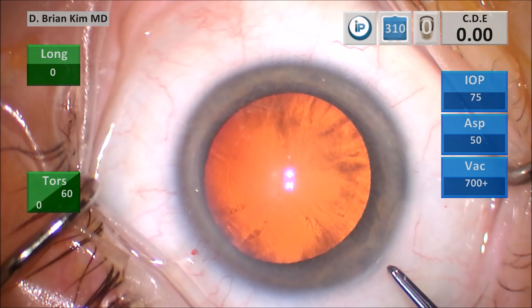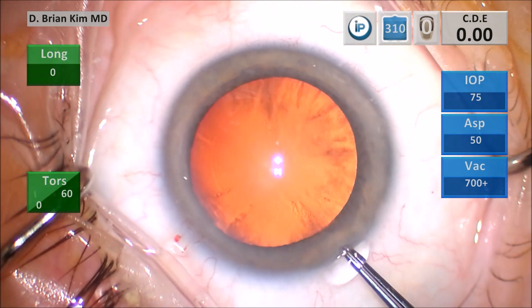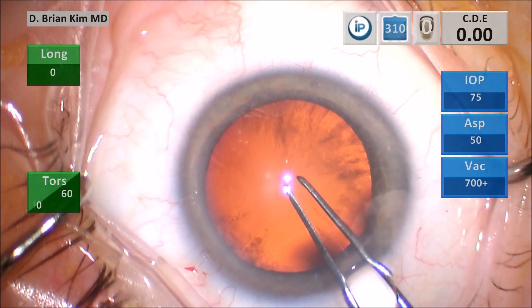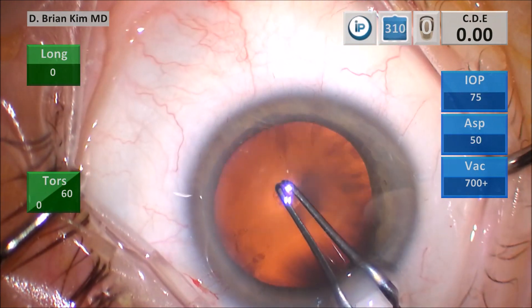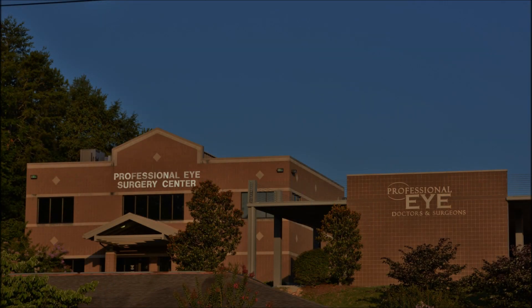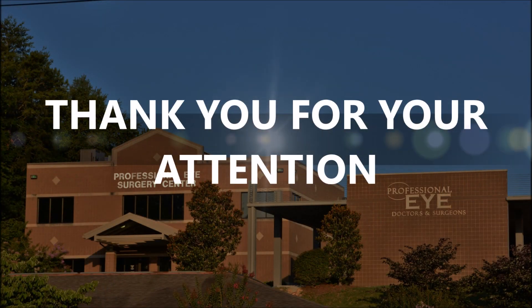I hope you see the value of creating a triplanar corneal incision. I believe it provides more stability, and using the cannula helps me maneuver to make my incisions. Using a diamond blade makes the technique easier. I hope this was helpful to you — thank you for your attention.